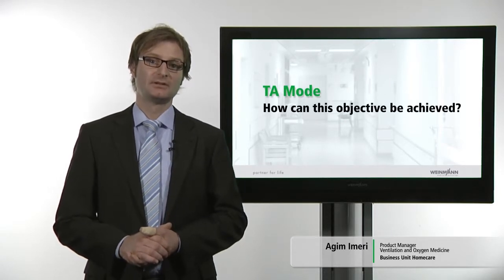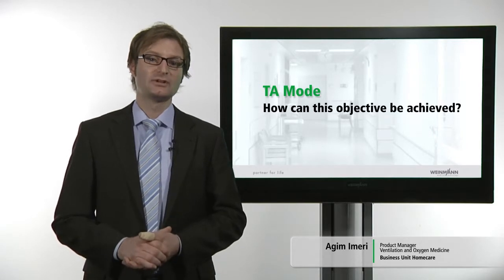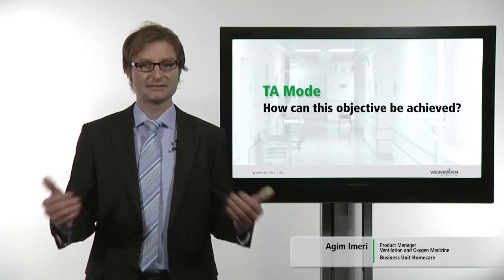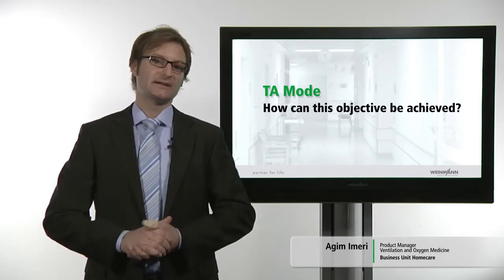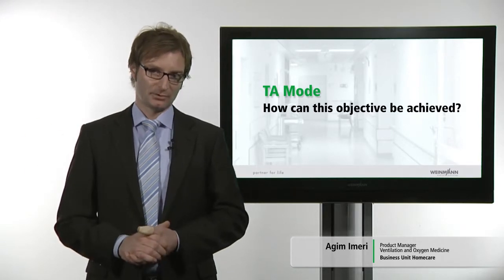First, settings are made for IPAP, EPAP, target respiratory frequency, the degree of freedom of the frequency, and the underlying type of disease. That could be obstructive, restrictive, or normal. These settings have an effect on the pressure curve later during ventilation.